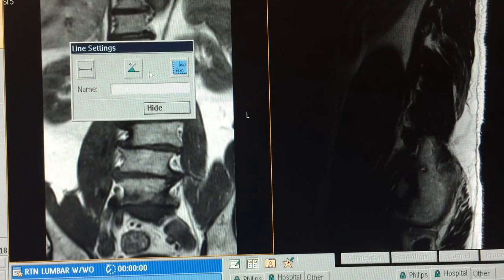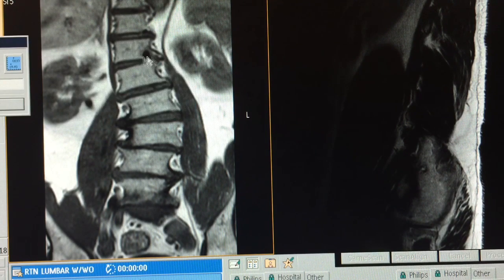Here you can name your line setting however you want. Highlight the angle option and you'll be able to draw an angle — it doesn't have to be perfect, it's just a rough guide. Right-click again to create another angle, then right-click to let go.